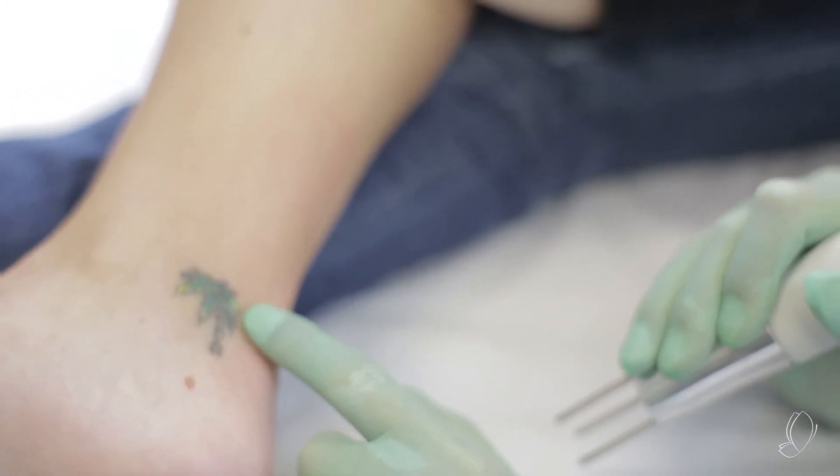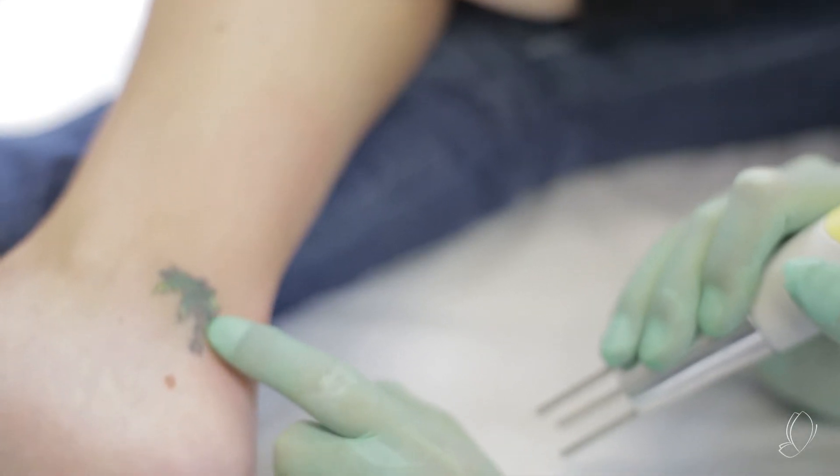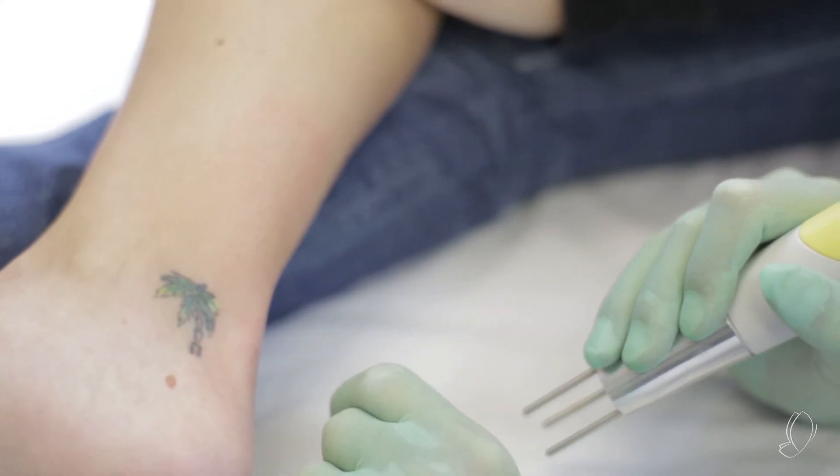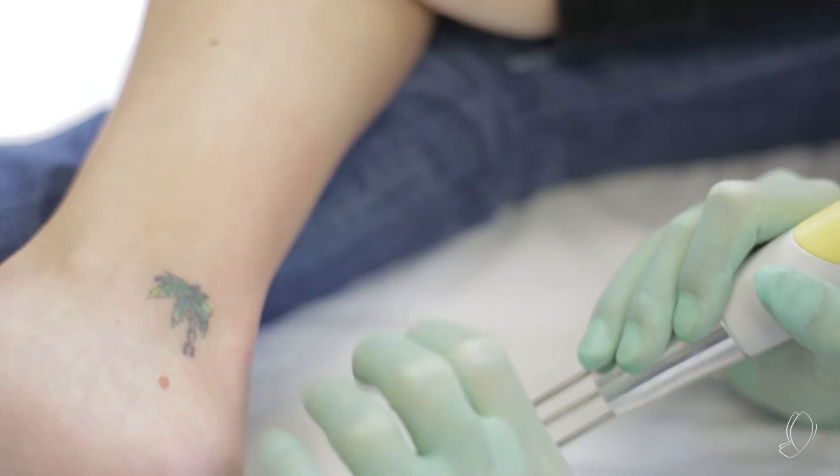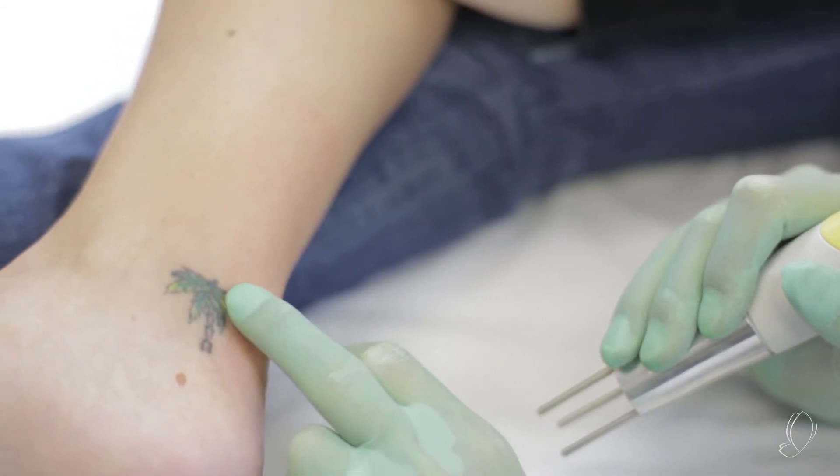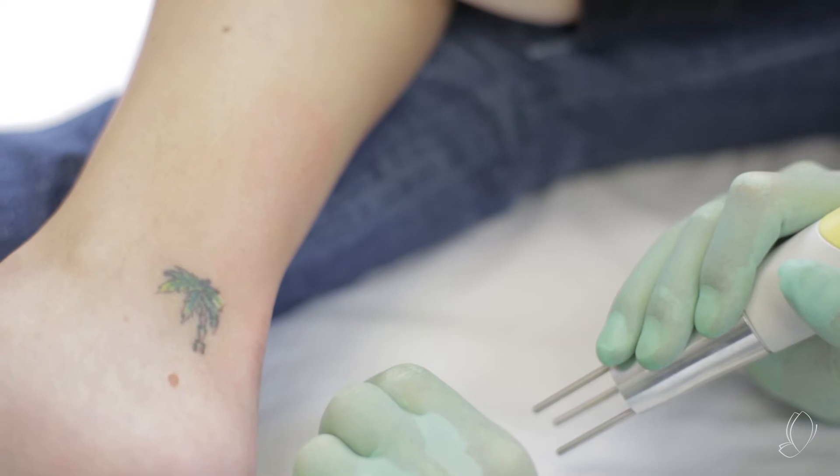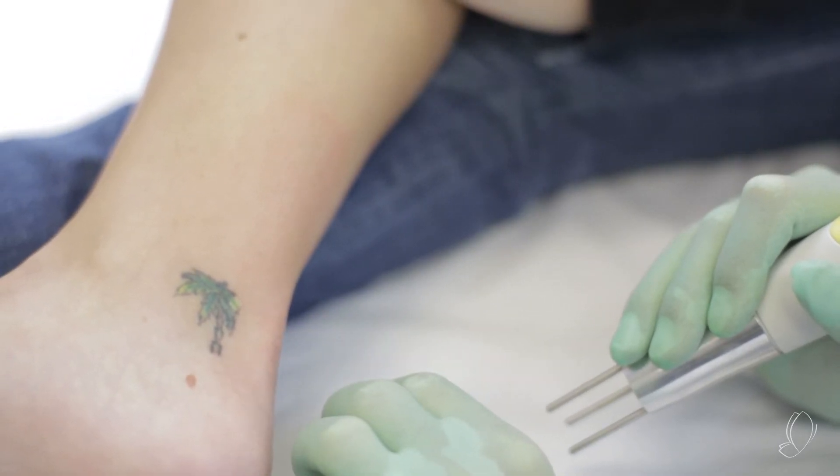Okay. Now, what we did get is we're going to go over the whole thing because we got the type of reaction we're looking for. We got a nice frosting, not too much, just a little bit of raised tissue, but that's really the sort of treatment that we're looking for.